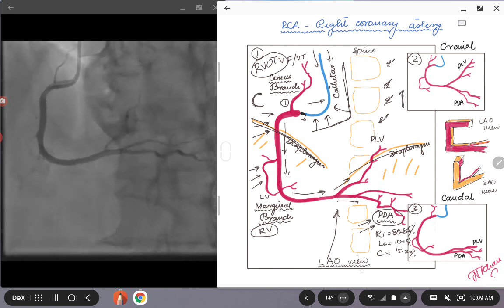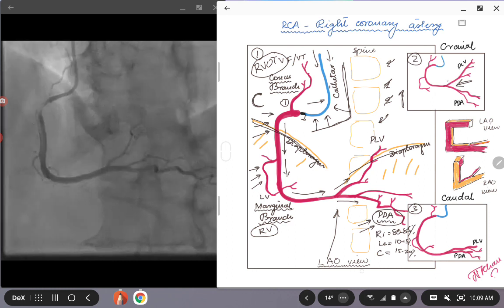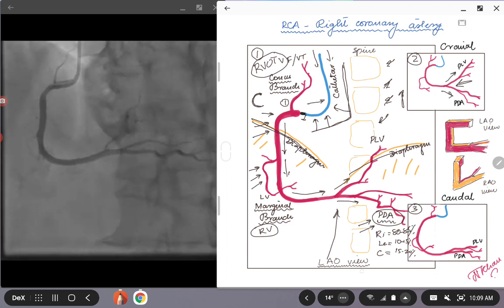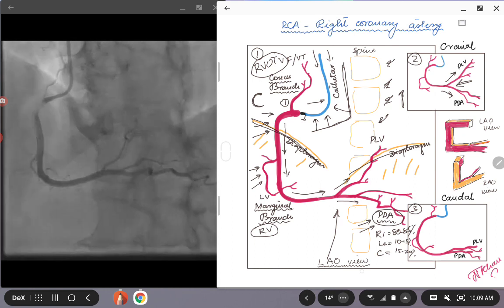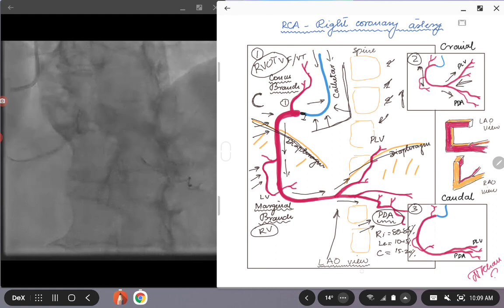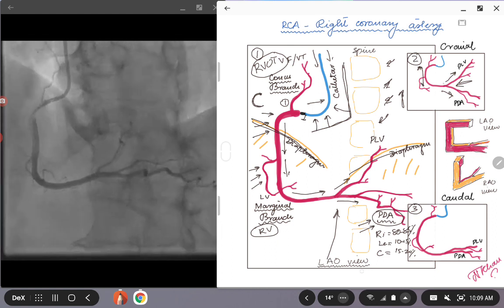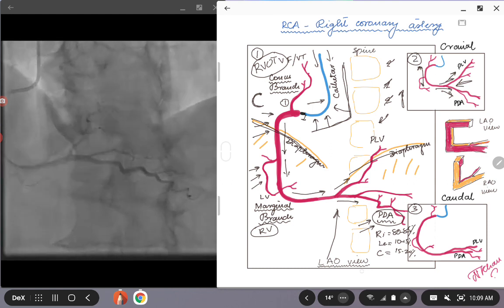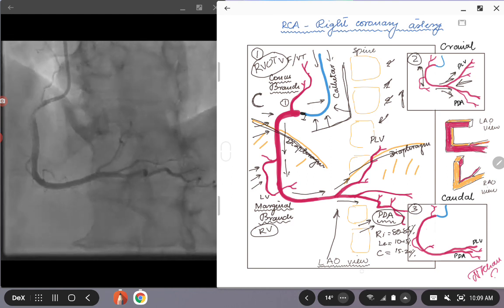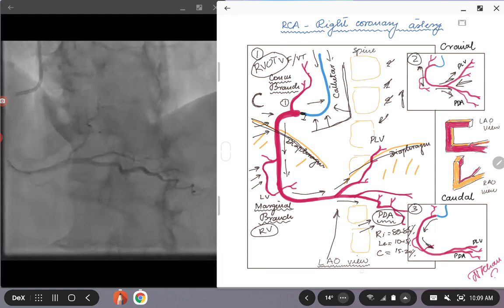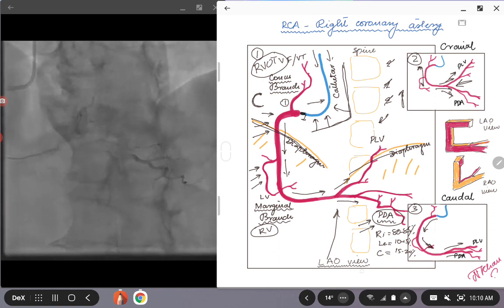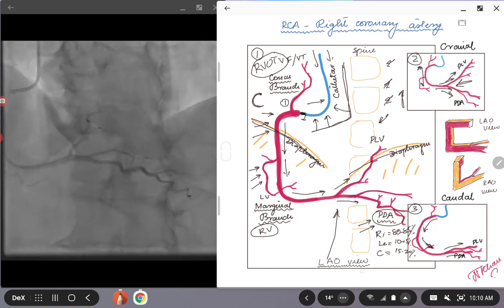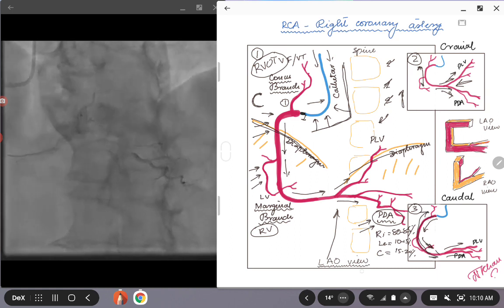If you want to look at the distal bifurcation, let's see in this picture two, and you want to separate the PLV and the PDA, you might add a little bit of cranial angulation. By doing that, you might foreshorten the body of the right coronary artery a little bit, but still you can see that. You might see the bifurcation more obvious if you move the II towards a little cranial position. And if you are trying to look at the body of the right coronary artery and not very much interested in the PLV or the PDA branch or their bifurcation, you can move the II to the caudal position. That way it's gonna open up the right coronary artery more so that you can see more of the body of the right coronary artery.